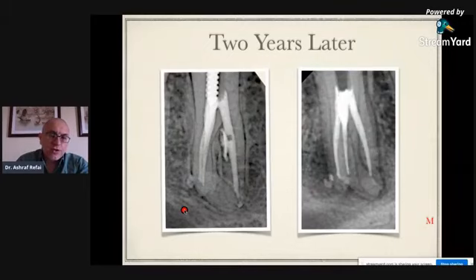This restorative work is not my restorative work. I think a doctor actually did a perforation here during restoration. This was my immediate post-operative, and I had just seen her, so I took a post-operative X-ray just to make sure that everything was healing fine.